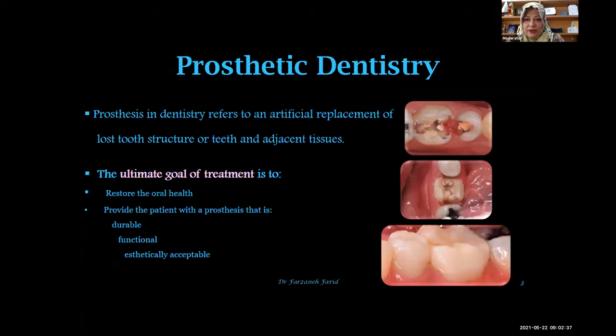At the right side, you see an endocrown that was done by our graduated resident at TUMS. Actually, this kind of treatment can be done by digital technology or by conventional technology like heat press technology. So the most important point for us is how to restore to the best, not the kind of technology that we are using.